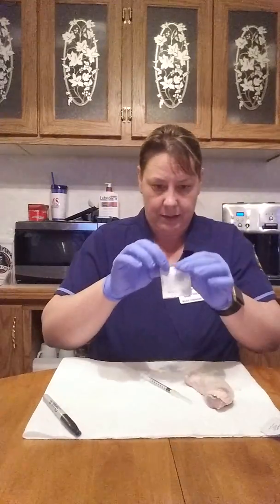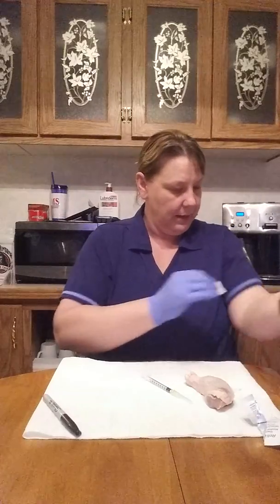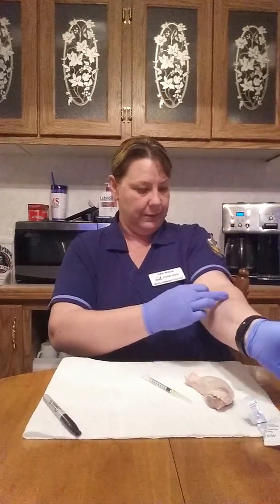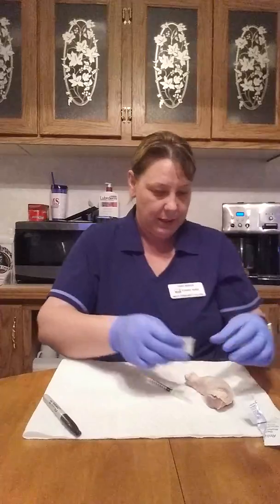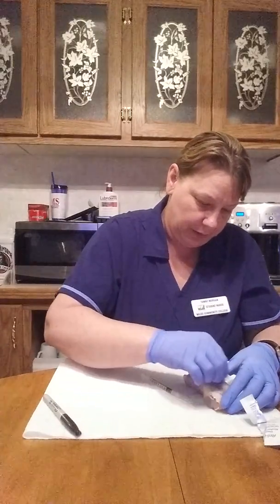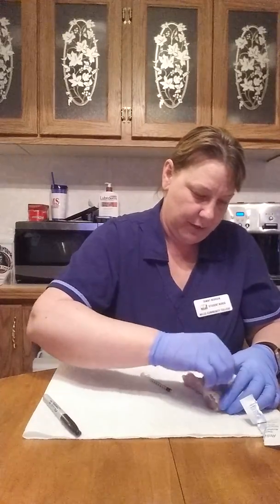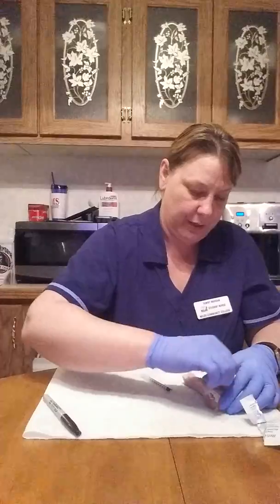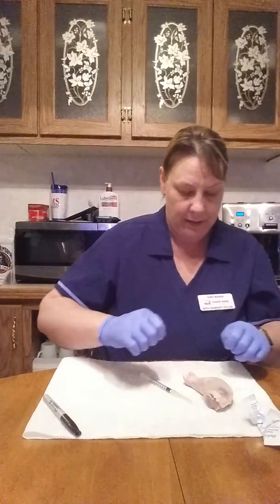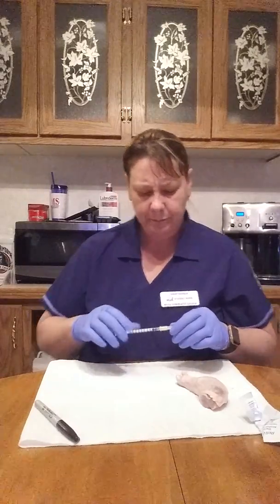So I'm going to take another alcohol swab, and in my spot that I've chosen, I'm going to go ahead and clean, and I'm going to start in the middle using a circular motion, making a circle going out, pushing the dirt out to the outer edges. And once I've done that, I'll let the alcohol dry. Without blowing it, I won't blow it dry.